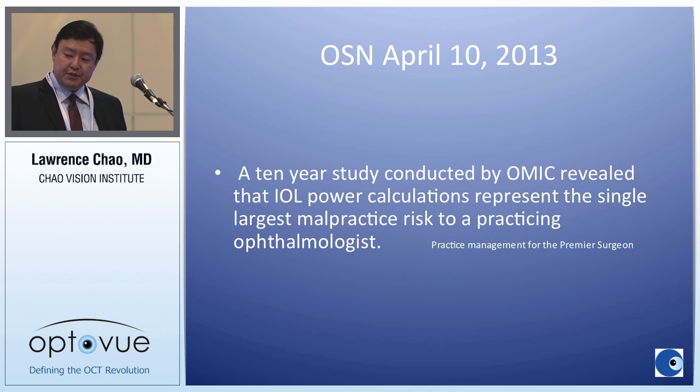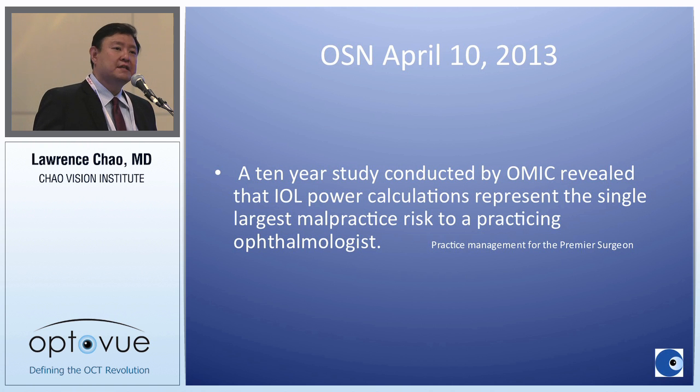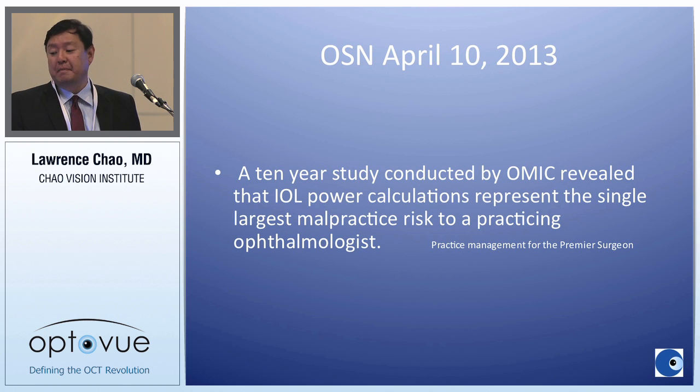It's interesting, I was paging through the OSN, Ocular Surgery News, about 2 weeks ago, and I believe this was an article from Mitch Jackson out of the practice management section, but I thought this was a very interesting factoid. A 10-year study conducted by OMIC, Ophthalmic Mutual Insurance Company, revealed that IOL power calculations represent the single largest malpractice risk to a practicing ophthalmologist.